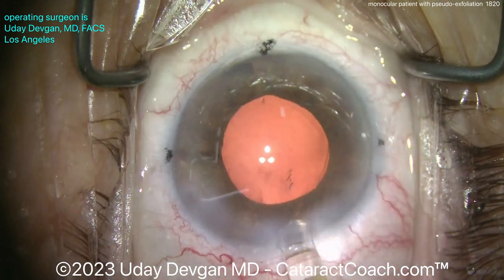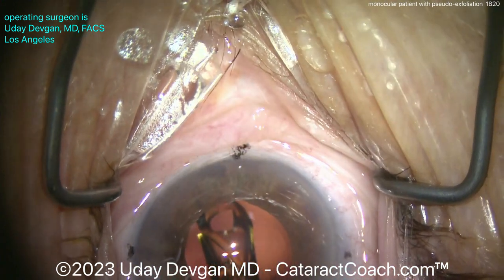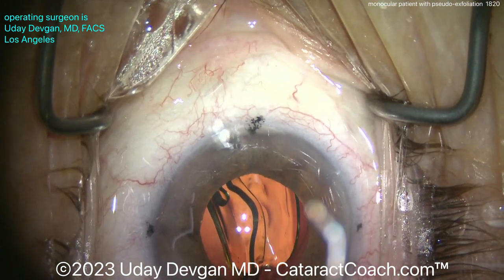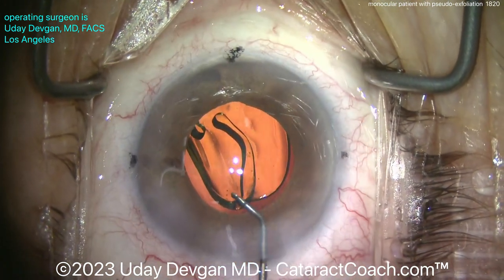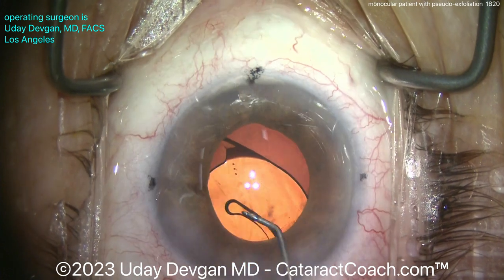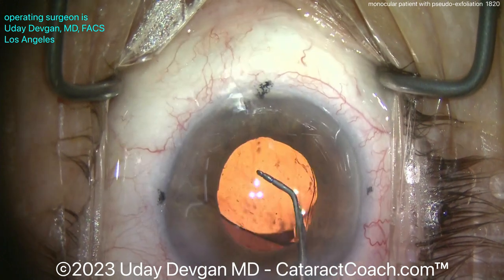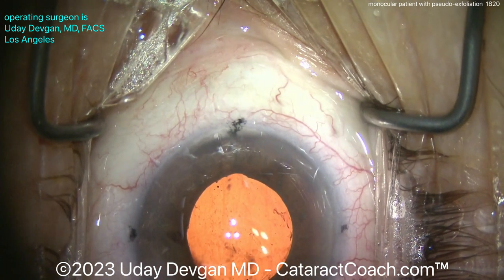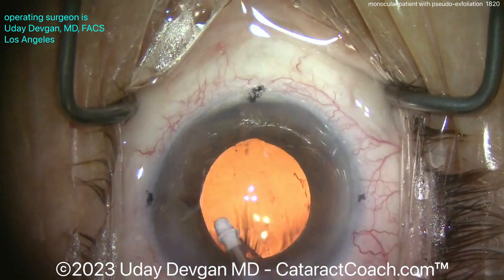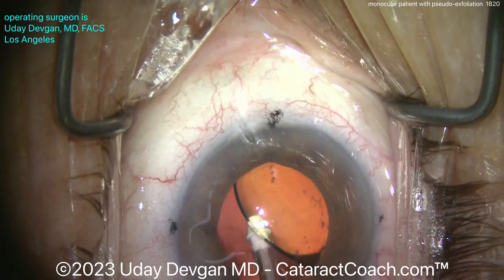Now it's time to put the lens in. Here comes our single-piece acrylic lens — this is a T5 toric lens, which has about two diopters of astigmatism correction at the corneal plane — going into the capsular bag. You can see just how small the eye and pupil are compared to the six-millimeter optic. We need to get that haptic to open up, get it positioned, and definitely go behind the optic with viscoelastic. With a toric lens you don't want it to mis-rotate due to retained viscoelastic.